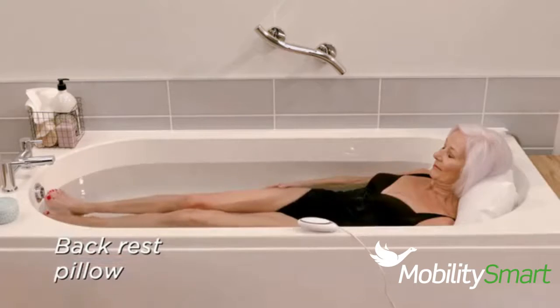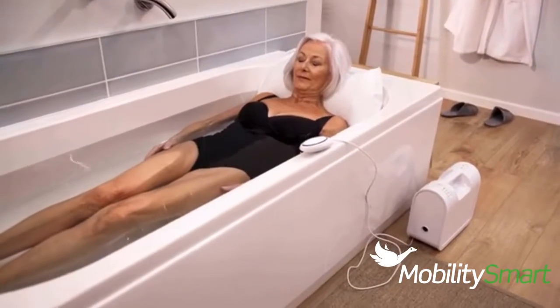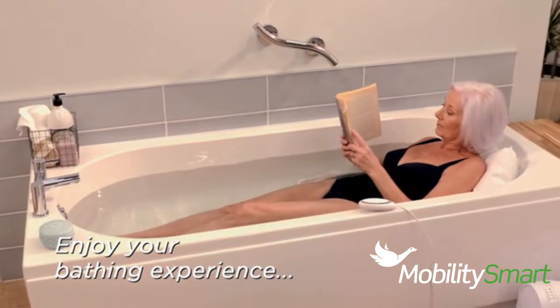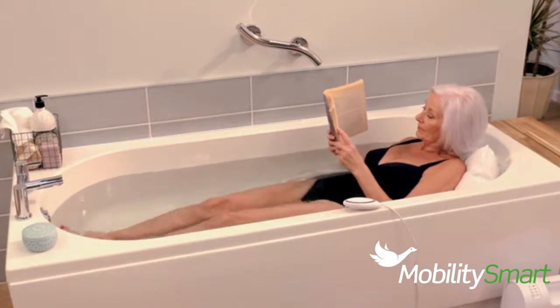Designed with minimal seams, the bath lift is comfortable against your skin. Let any stresses, aches or pains melt away and really enjoy your bathing experience. Listen to the radio, even read a book. With the bath lift, you can relax in a fully reclined bath without the worry of how to get out.